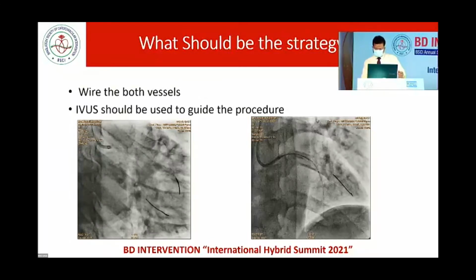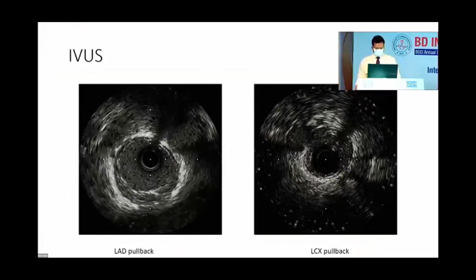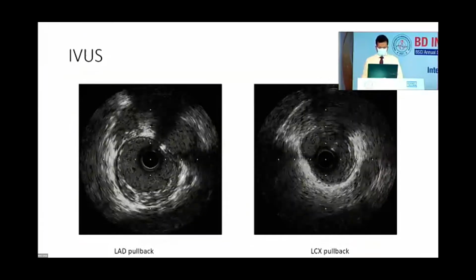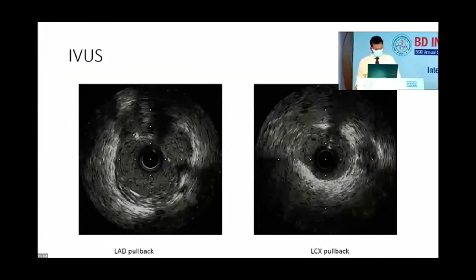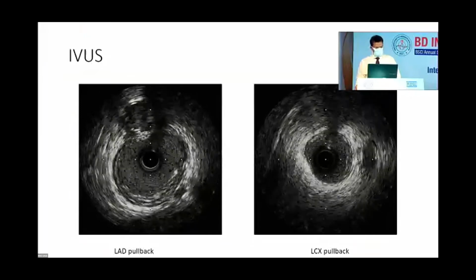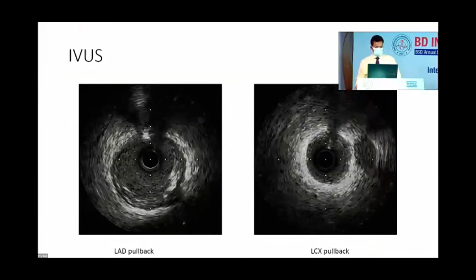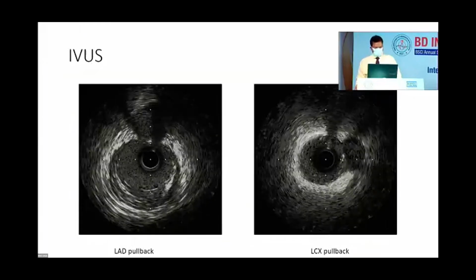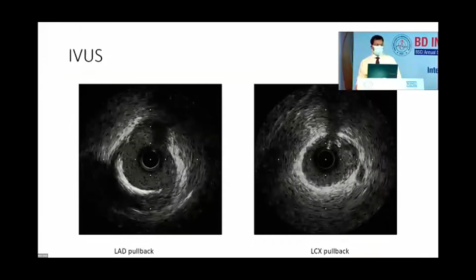And the result of IVUS. This is the LAD pullback, and this is the LCX pullback. The longitudinal view was also essential.